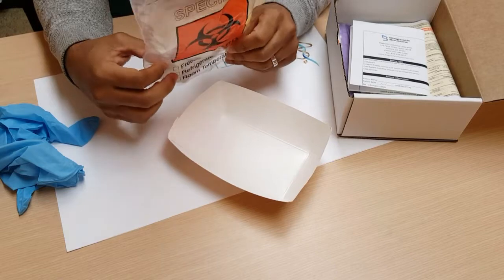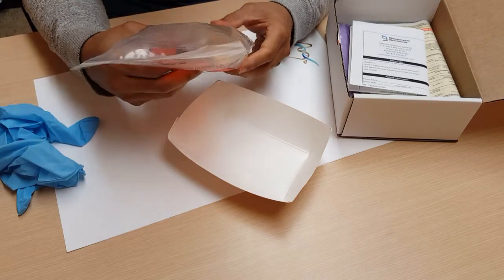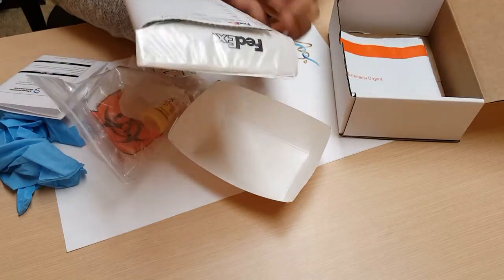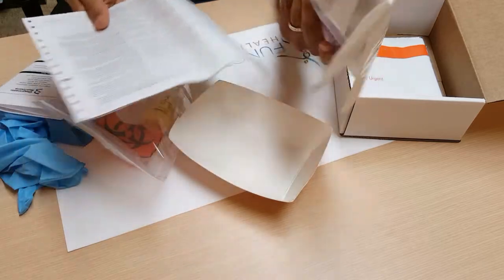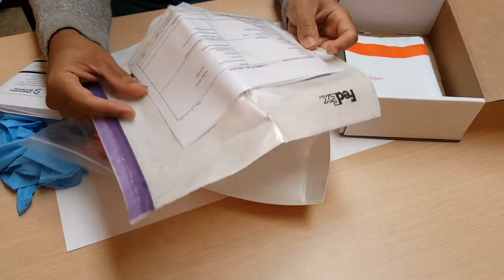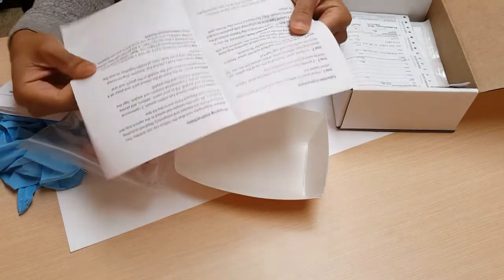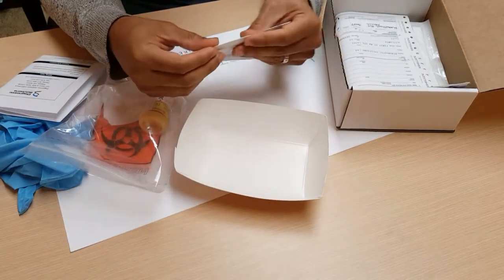If you're not shipping it that day, place the sealed box in the refrigerator overnight until you're ready to send the sample. The last step, since you've already filled out the requisition form, is to set up the shipping. The shipping is prepaid, so fill out your sender information on the FedEx label. On the commercial invoice — which has three pages — fill in your personal name, address, and similar details. You can either call FedEx to schedule a pickup, their number is on the instructions, or take it to a FedEx shipping depot yourself.